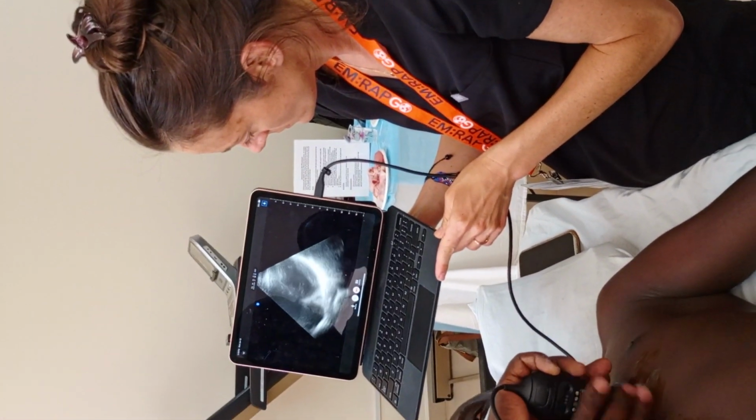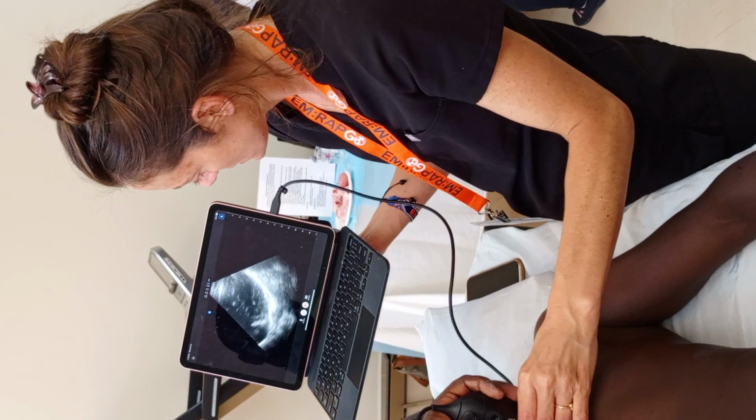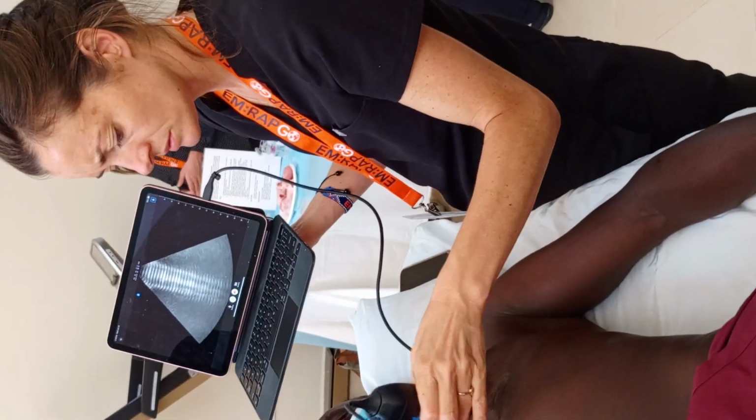Otherwise, the needle will start twisting on the skin and it will pull the skin and it's harder. So you go in straight in, hit bone, and on that side, it's a little weird because it's so far in.